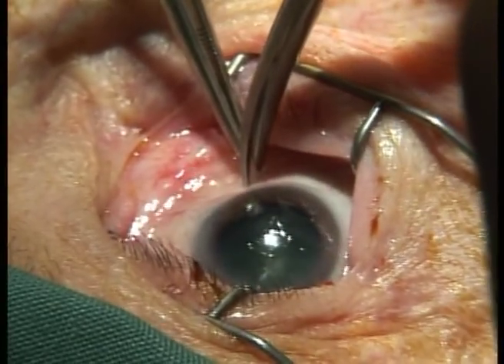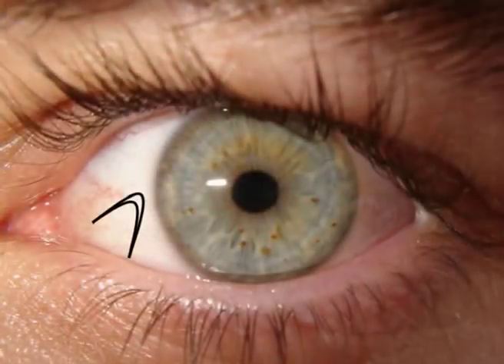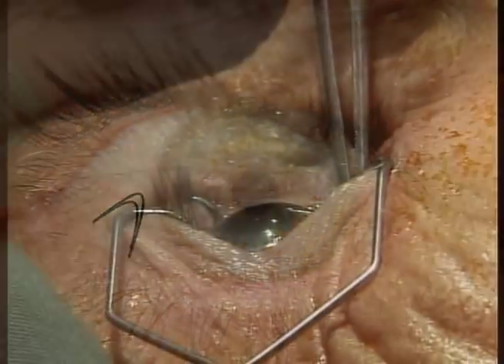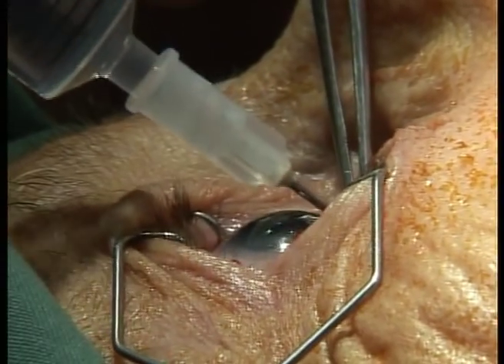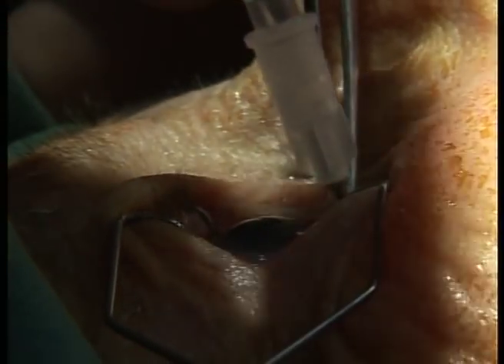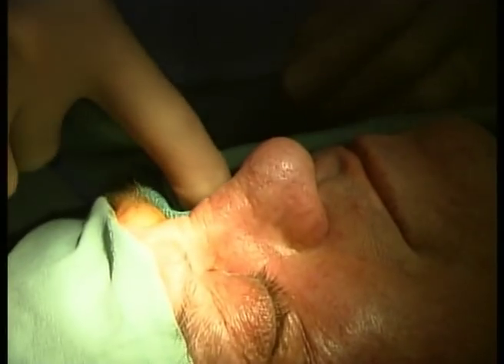Note the vertical scissors. Scissors brought in horizontally will cause an arcuate incision. A flap of conjunctiva on the concavity of the arc may fold in and cause an inclusion cyst. When inserting your cannula, follow the contour of the globe by bringing the syringe up to almost vertical, rather than heading off on a tangent, which can cause pain. Apply gentle pressure to the incision point for a couple of minutes after the block.